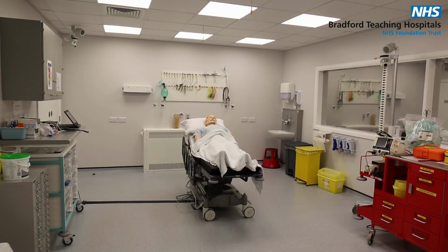During this short video, you will see what equipment will be available for you to use during your scenario, and we will also look at the main features of the mannequin that we are using. This area is designed to replicate an emergency department or AMU setting. You will be told at the start of your scenario the exact setting your scenario is based.